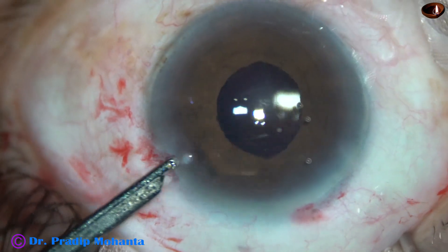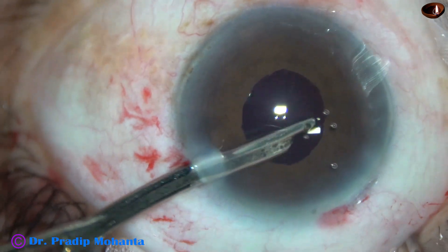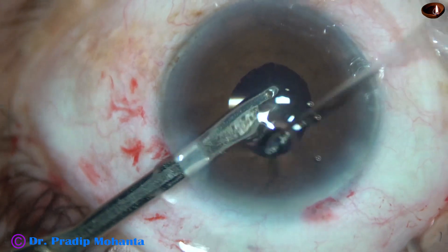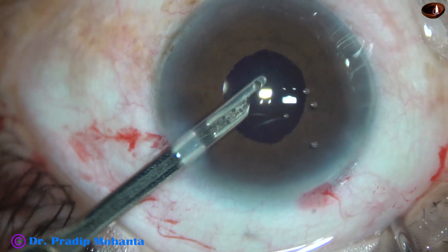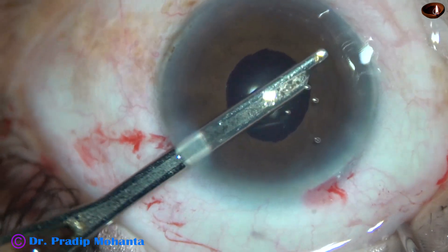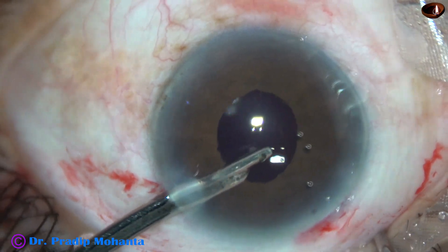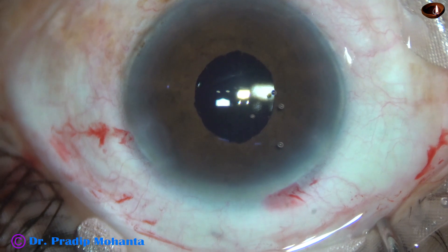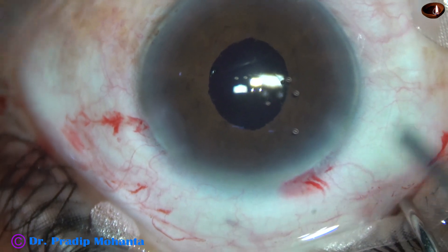Go through the side port and remove some more viscoelastic. I give a lot of time in removing the viscoelastic. I don't depend on drainage of this viscoelastic substance through the trabecular meshwork. Now I take the bimanual irrigation aspiration.